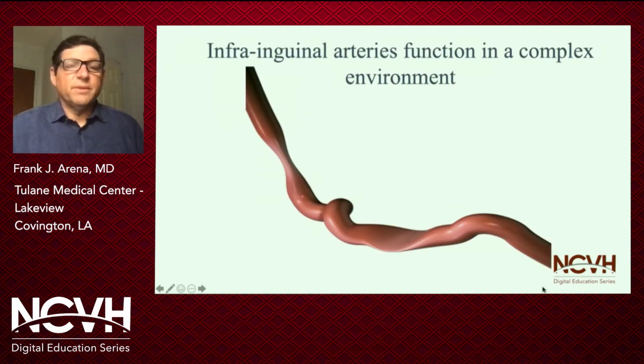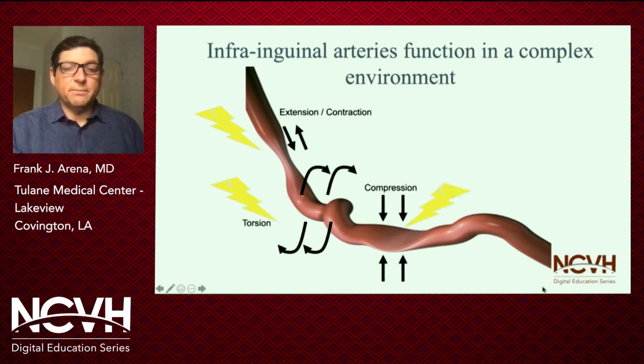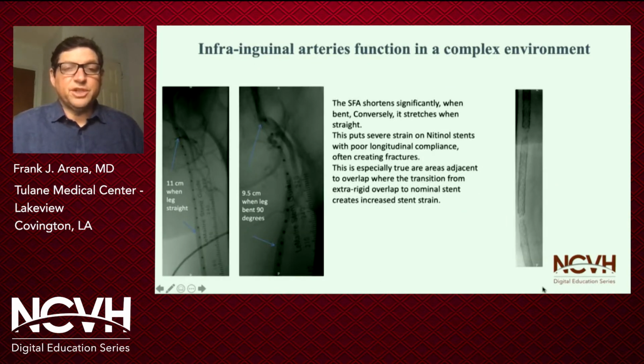Everybody's seen this slide before. The SFA stents function in a very complex environment in the infra-inguinal arteries. They extend and contract, they twist, compress, and flex. But I don't think people really appreciate how much of a hostile environment it is for these stents.